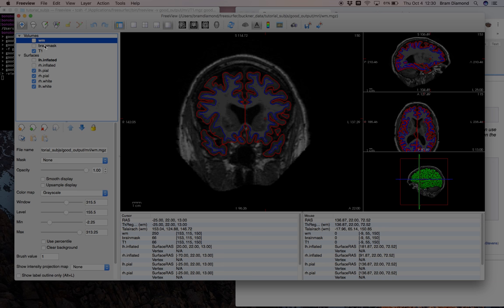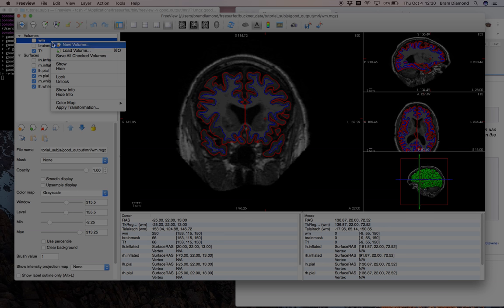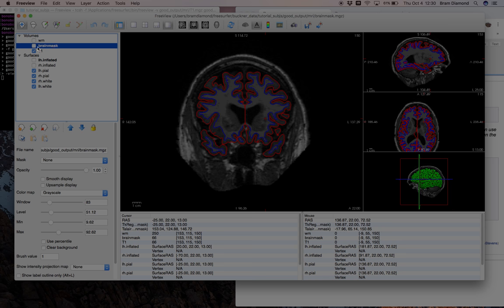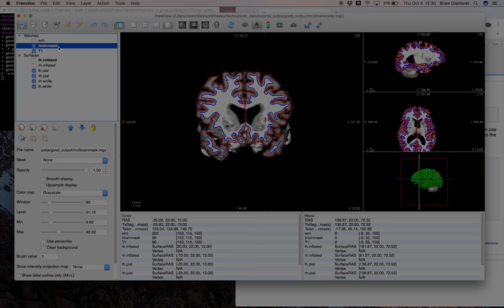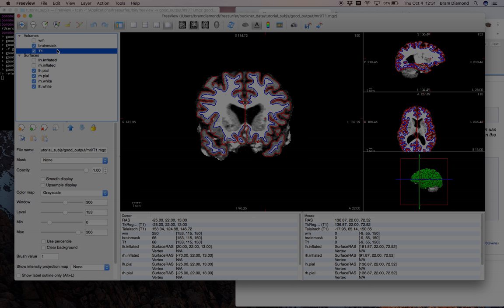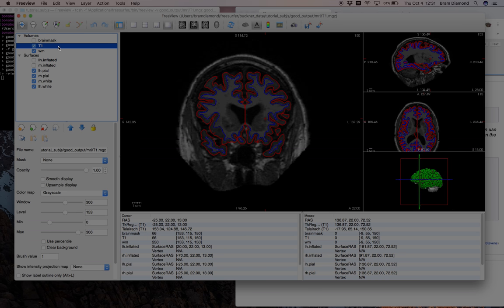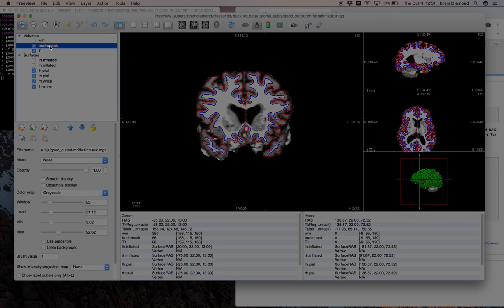You can change visibility by checking or unchecking volumes, right-clicking and pressing show, or using Alt+V on Linux or Option+V on Mac. You can also cycle through volumes to change what is rendered on top by pressing Alt+C or Option+C on Mac. You can also load and remove volumes — there's more than one way, such as pressing the close button, going to File > Close Volume, or using the load volume button or File > Load Volume.